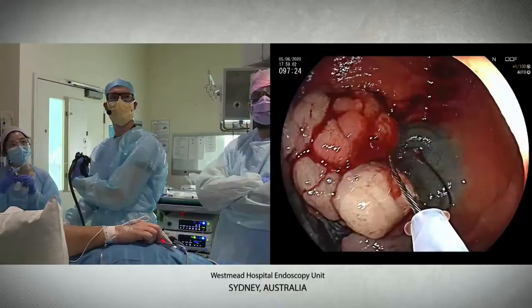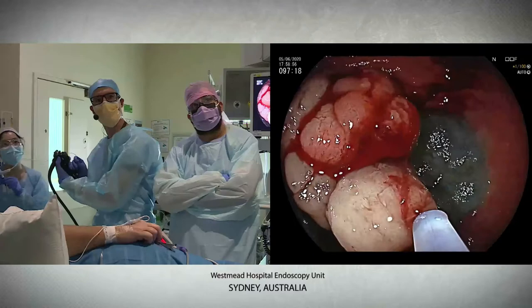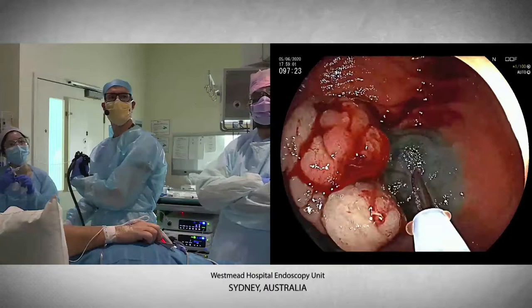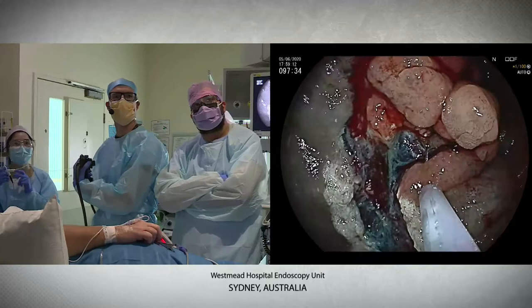So I guess we'll just take off this nodule here. Then we might be able to see over the back a little bit more in that way. So yeah, just open the snare there. Open right full, yeah. We probably want to move back to the 15, although that's pretty well got that area there. So it's just closed there.